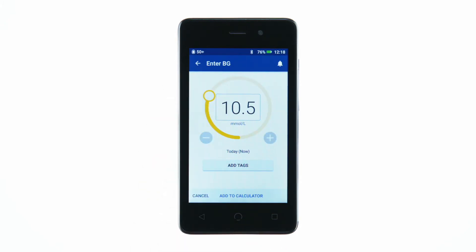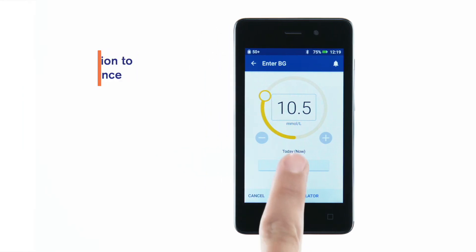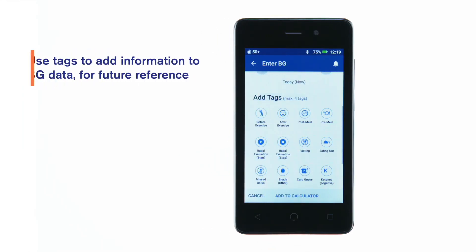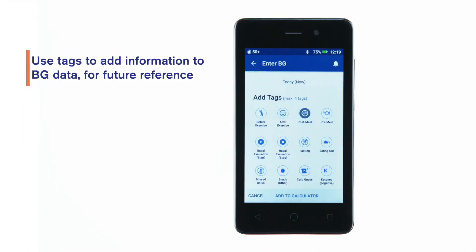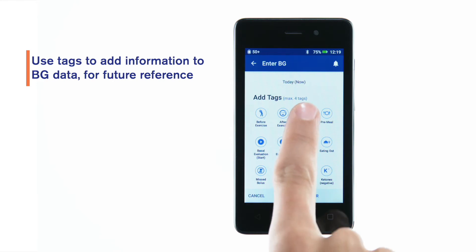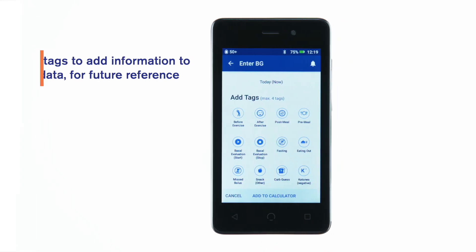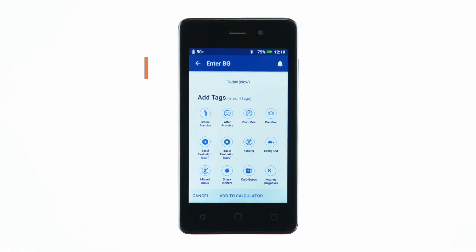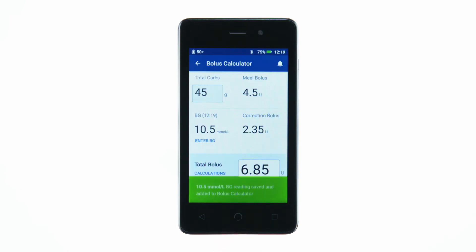If you'd like to tag the BG reading, tap Add Tags and tap a tag. Tap again to deselect a tag. You can add up to four tags. Tap Add to Calculator. You will see your BG value entered.